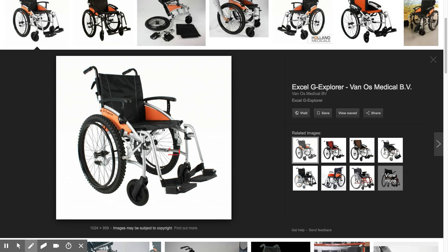Now, unless this wheelchair is a specific size smaller than the normal size, this section of straight bar would be more than 2.5 inch, and therefore the folding adapter can go across and attaches to each side. It then has a front arm of the adapter, and the FreeWheel connects to that and comes out in front, over and in between the footrest.